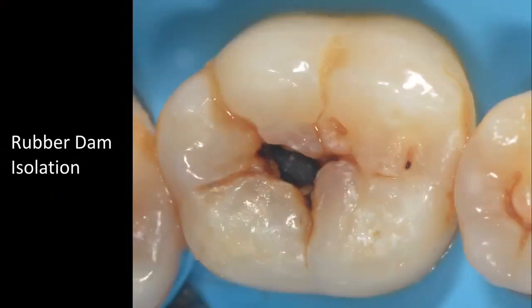Application of the rubber dam again. See the eversion of the rubber dam. It's beautiful. No seepage of saliva can be seen if you apply the rubber dam well.